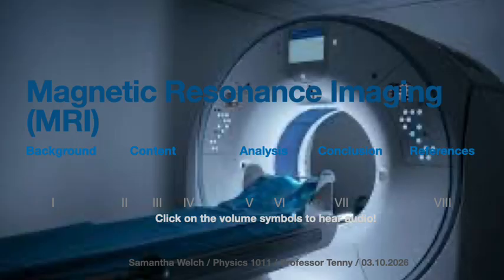When radio frequency waves are applied, the hydrogen nuclei briefly absorb energy and then are able to release that energy as they return to the alignment with the magnetic field. The MRI machine detects those signals going off and uses them to construct a very detailed image of the internal structures of the body.